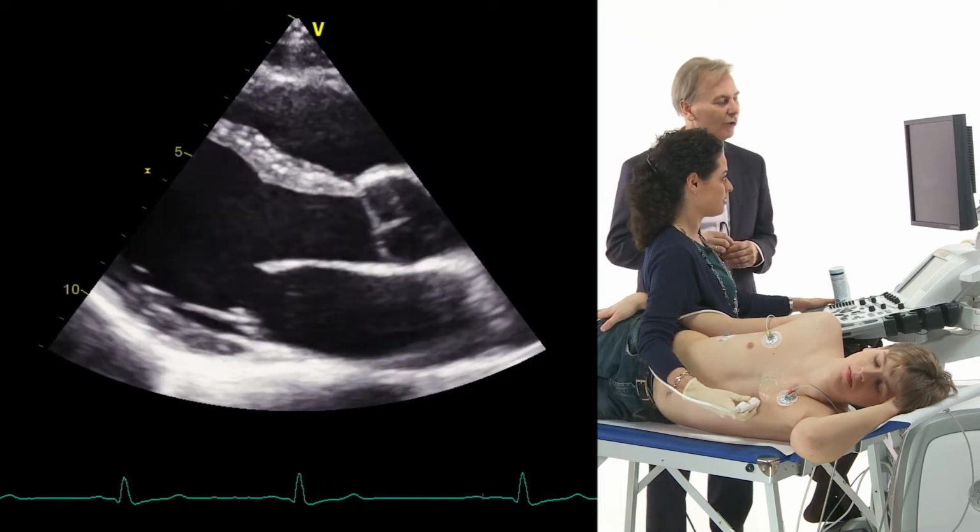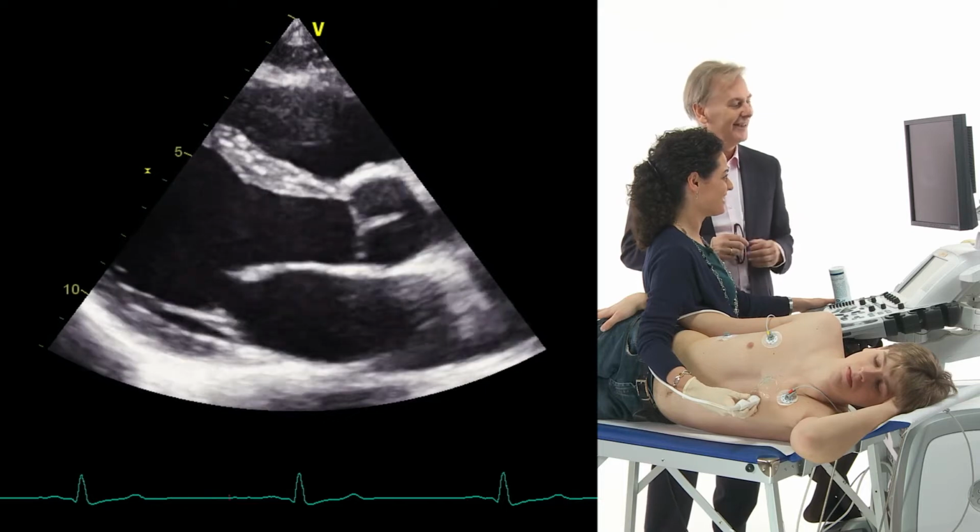Yes, it's an absolutely normal valve. After all, this is my son here, and I hope he is normal.